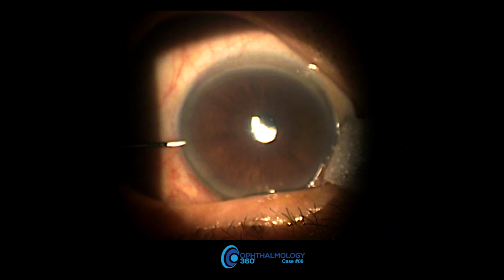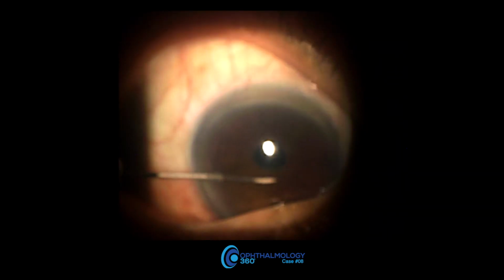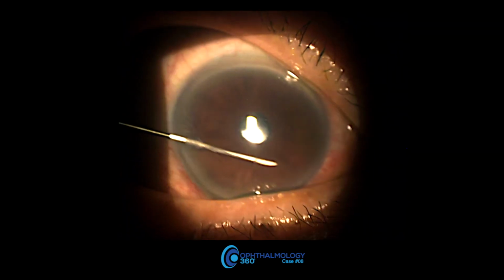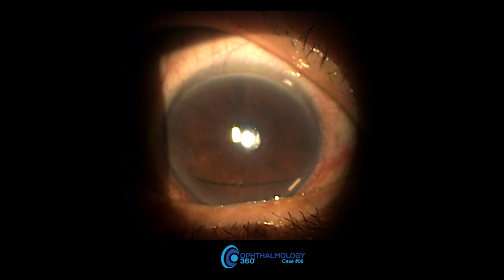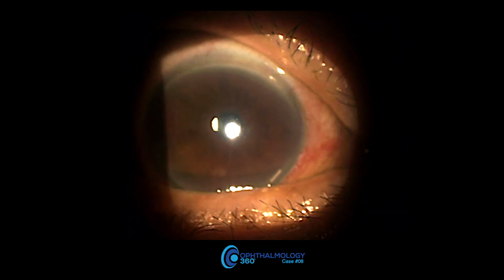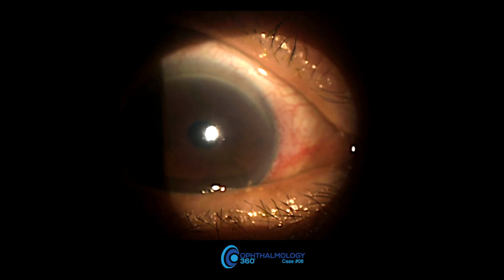It's also very helpful to make sure that your staff member keeps the forehead as far forward as possible. I went in a little deeper than I do now when I first started, and I always try to stay below the pupil, and I went down for an angle and released the bimatoprost. And you can now see that, like a log, it starts to roll or slide like a toboggan into the inferior angle.